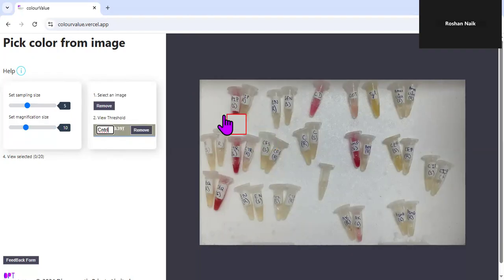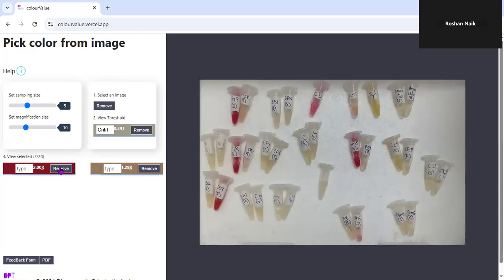Always make sure what the tubes are. First, look at the tube. Here we have piperacillin, which says S, susceptible. If you see here, it indicates red, which is higher. R stands for resistant. However, at the next dose the color drops. So although it is higher than the control, it will be an intermediate phenotype because the color drops here. So PIP would be an intermediate phenotype at best.